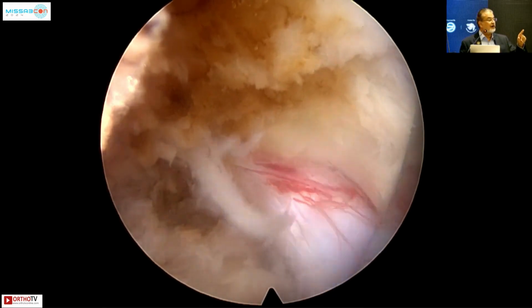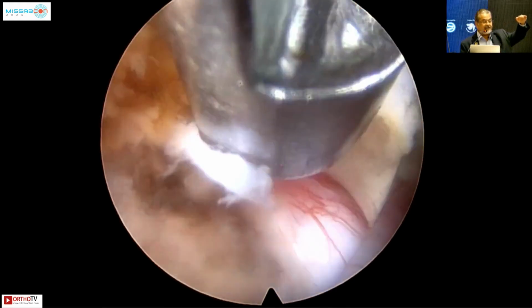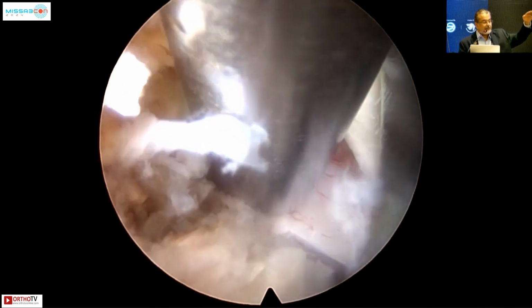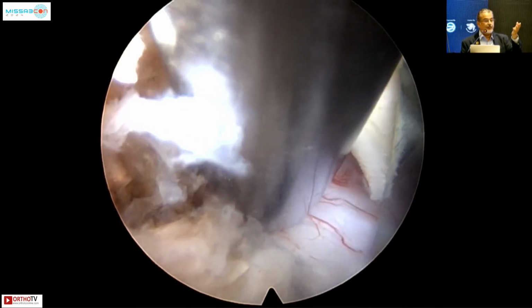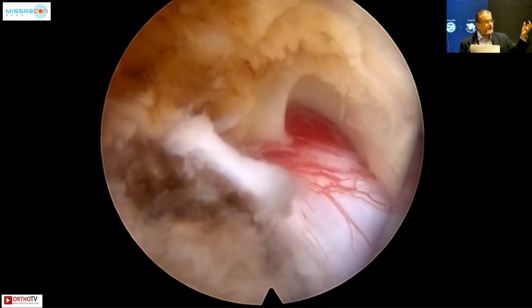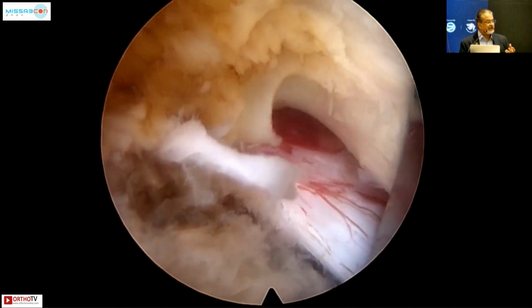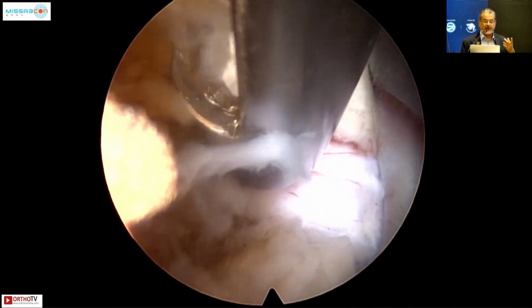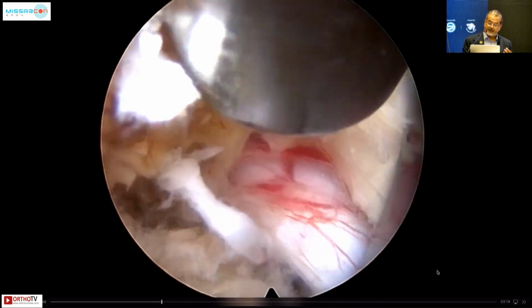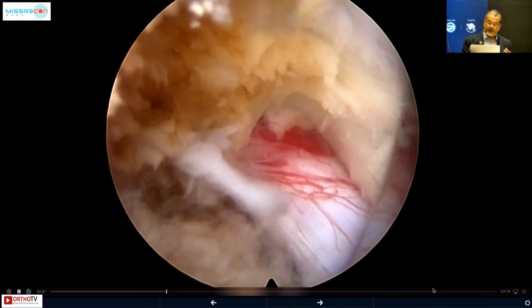This needs to go completely, and you should be able to get inside over the nerve root in the upper part of the foramen. In some cases where you have pars defects, you may have some kind of redundant tissue there, a non-union tissue which needs to be taken off. Laser and Kerrison punches are excellent tools to take it off. Now, how much do you go till you completely decompress the entire area?